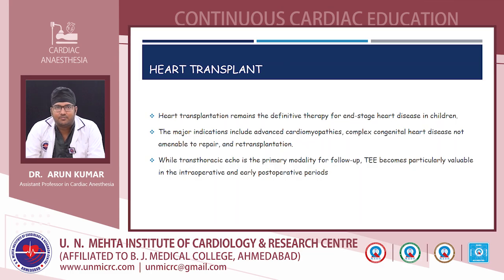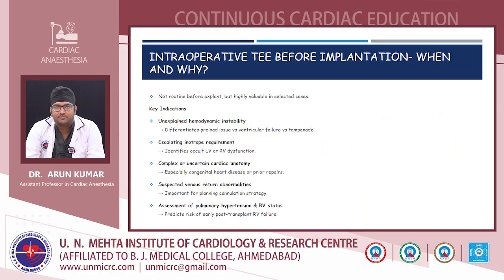Heart transplant remains the definitive therapy for end-stage heart disease in children. The major indications include advanced cardiomyopathies, complex congenital heart diseases not amenable to repair, or retransplantation. While transthoracic echo is the primary modality for follow-up, TE becomes particularly valuable in the intraoperative and early postoperative periods. So, intraoperative TE before implantation: when should we do it and why.